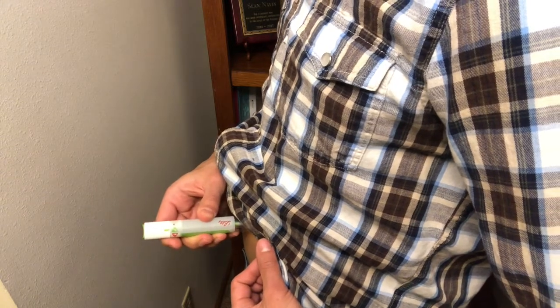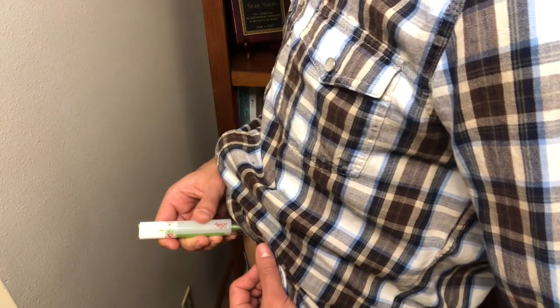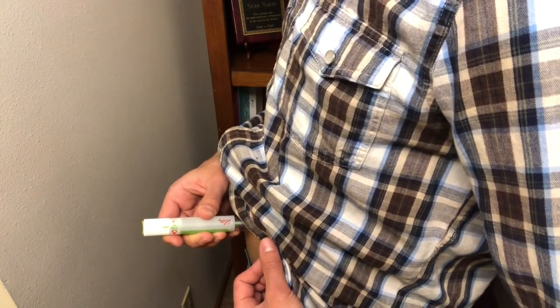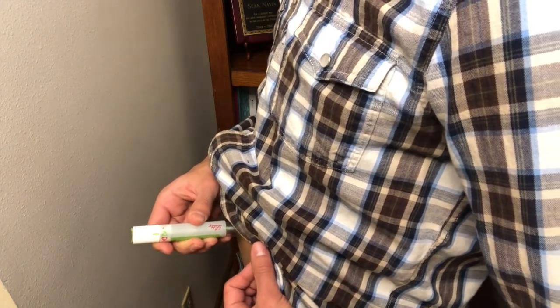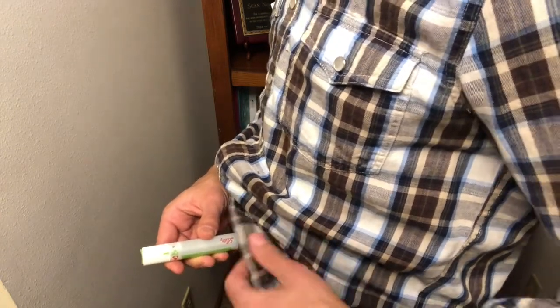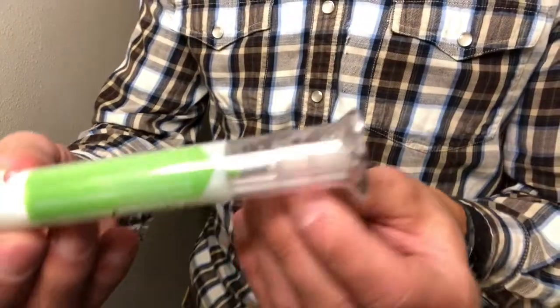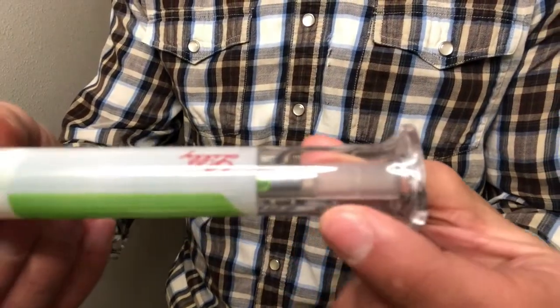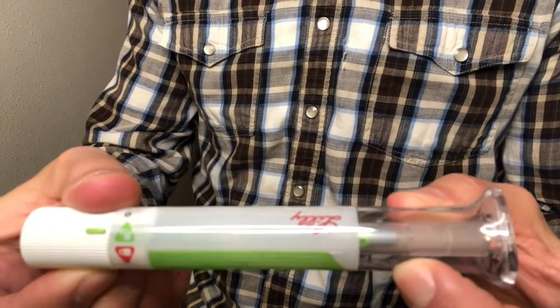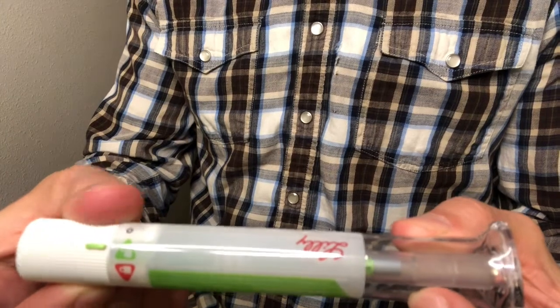So you hear the click, and I'm holding for 5 to 10 seconds until I hear another sound. So there's that second sound. Once you hear that second sound, again, it varies on the time, but it's usually 5 to 10 seconds. Then you can remove the pen and you are good to go. So that's pretty much it. Notice now this gray part, kind of hard to see with the light there. The gray part has come in, so that's when you know it worked.